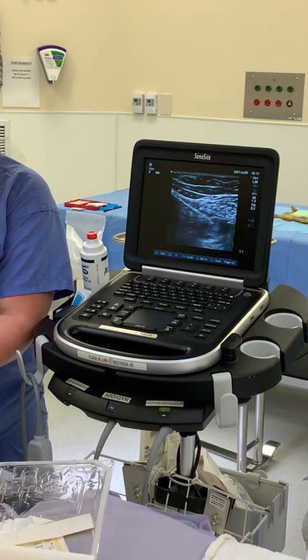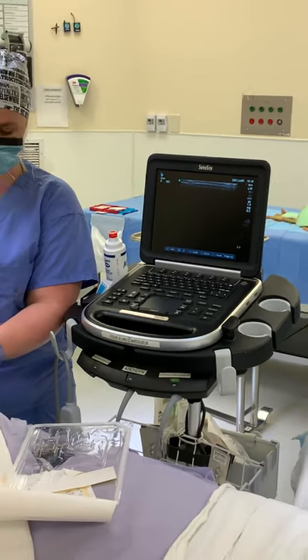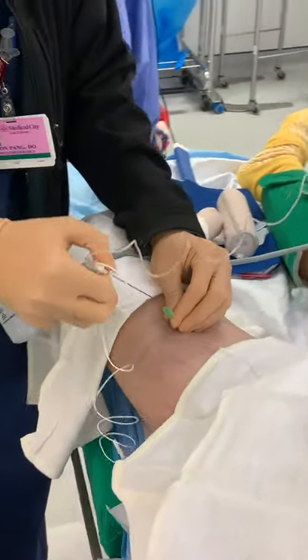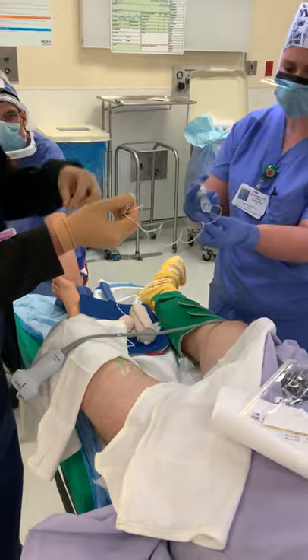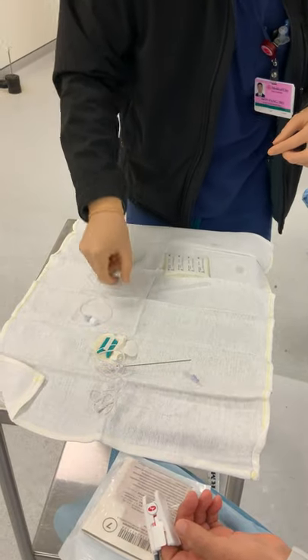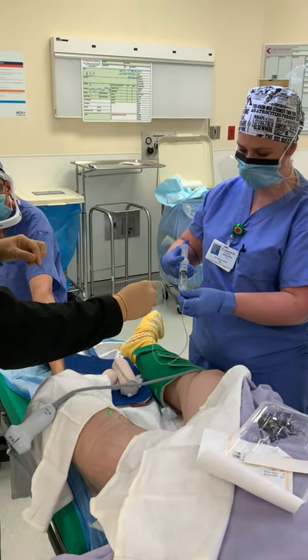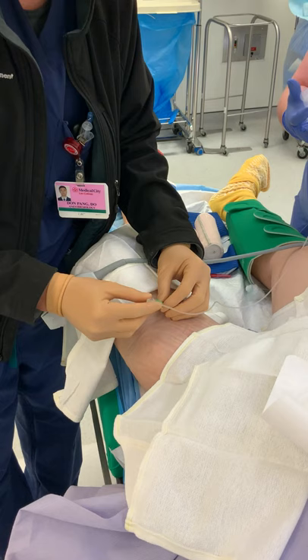We are going to drop the probe, and here you can see I'll be removing that white part like we talked about. So we're going to unscrew the white, take out the needle — and see that the needle was disconnected. Now I'm going to have my assistant remove that syringe. We're going to take our nerve catheter and hand it to our assistant, who will flush through and get that air out. Then we're just going to slide it through that clear sheath like so.